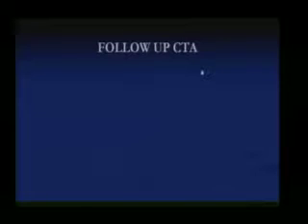We did get a follow-up CTA. Usually the plan is to get a CTA in a month, but she was already in the hospital. She had some seizure activity, which we didn't know what exactly was happening. So I said, let's scan, make sure the stent graft is okay.